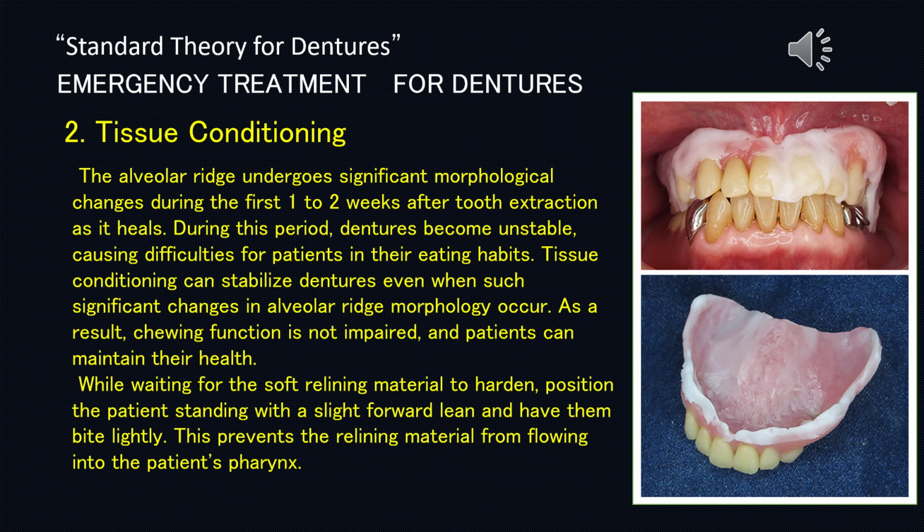While waiting for the soft relining material to harden, position the patient standing with a slight forward lean and have them bite lightly. This prevents the relining material from flowing into the patient's pharynx.